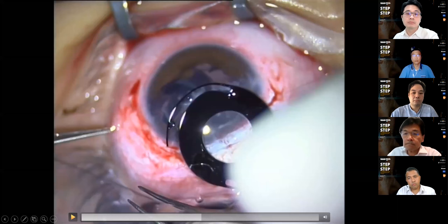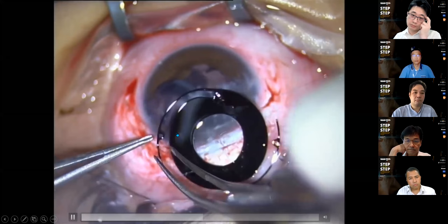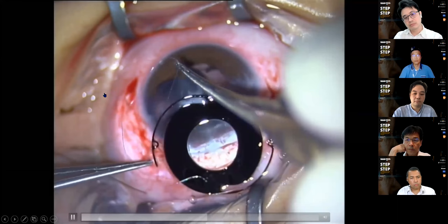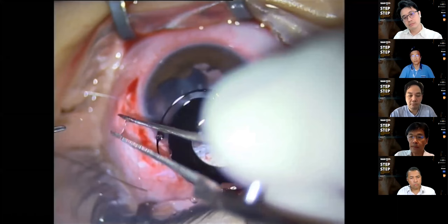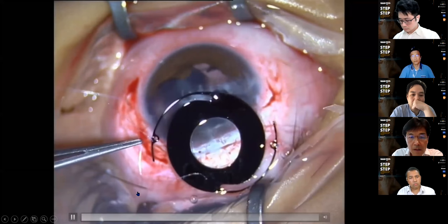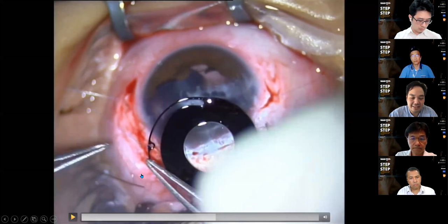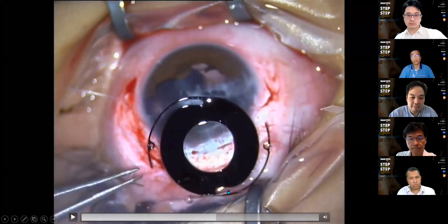Then you tie the other eyelet in the usual manner, with the knot facing outside of the eyelet, so that when you fix it, it's facing the scleral surface of the wall of the eye. All right, now it's time to please cut correctly. Don't cut the wrong suture. It happens. So now I just stopped the video for a while and I would like to mention a few things. Now we have this eyelet sutured to the right side of the flap, and this eyelet is supposed to go to the left side of the flap.